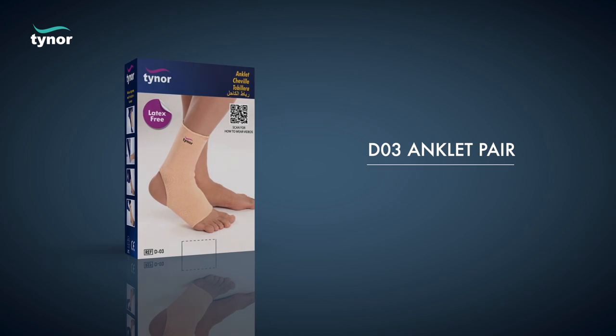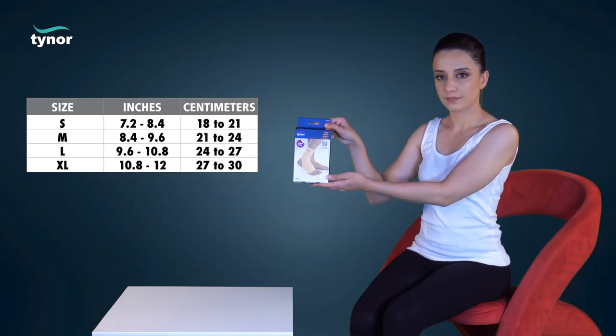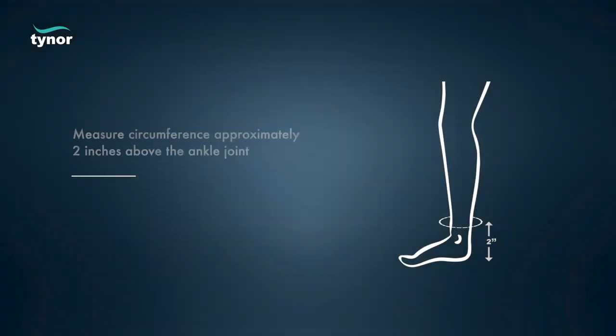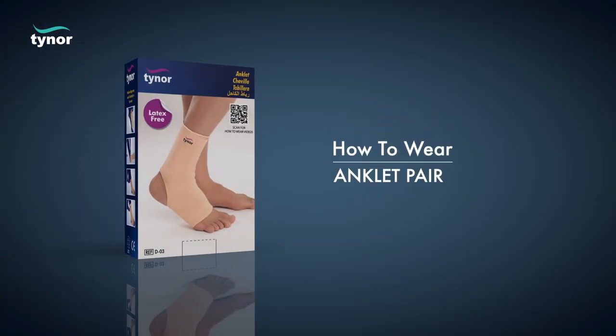Here we will discuss how to measure the size and how to wear the anklet pair. The anklet pair is available in these sizes. Measure circumference approximately two inches above the ankle joint. Now let us see how to wear the anklet pair.